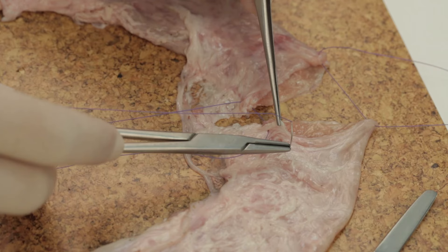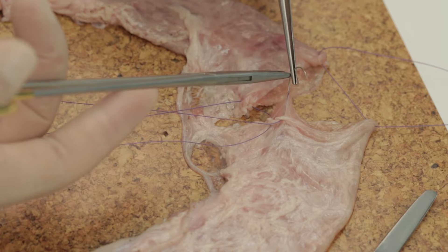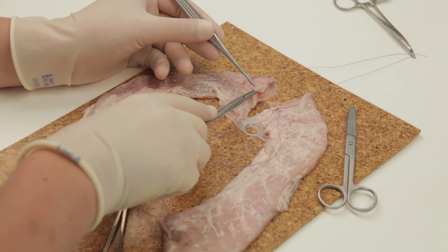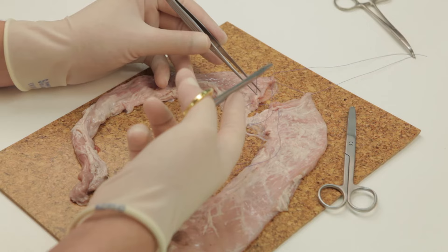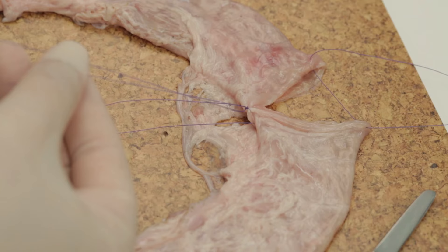Further interrupted sutures are then placed along the border of the cut edges of the bowel, being careful not to incorporate the mucosa into the bites. Ideally, these sutures should be placed 3mm apart. Here you will notice that the fourth suture has been placed at approximately 5 or 6mm, and we will return to this to illustrate the error.